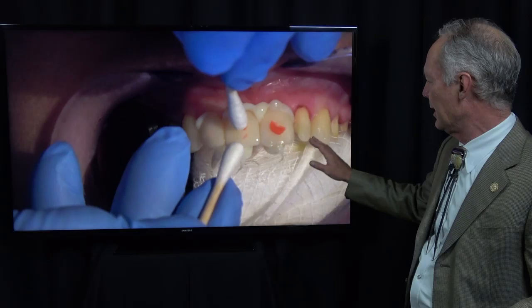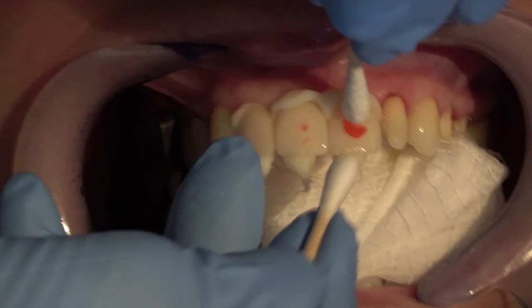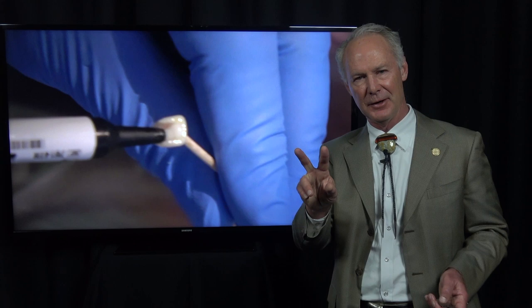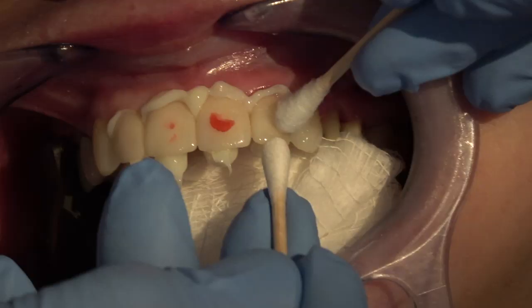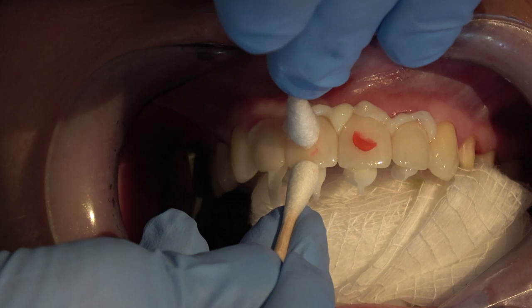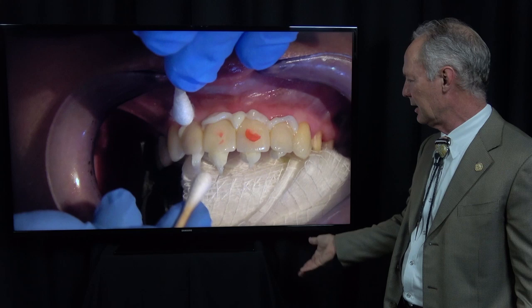If you try to put them on individually, you will not like veneers because you're always having to deal with bleeding. Or what if the veneer moved just a little bit so the adjacent veneers wouldn't seat? You'd hate your life. This way you know they seat precisely because you've tried them on. You know they're perfectly oriented and they align each other. Keep the tip in the material as you seat it, cotton tip applicators, and I'll go back and forth, back and forth, back and forth to be sure that each of the veneers is completely seated. And I'll look at it from the facial and then I'll look at it from the incisal.